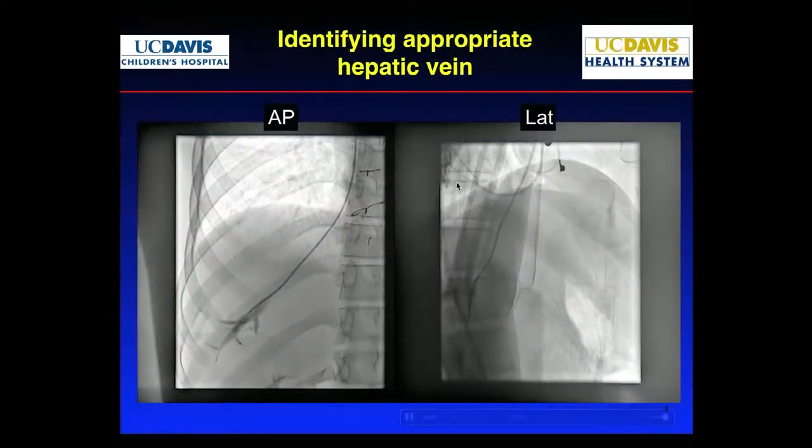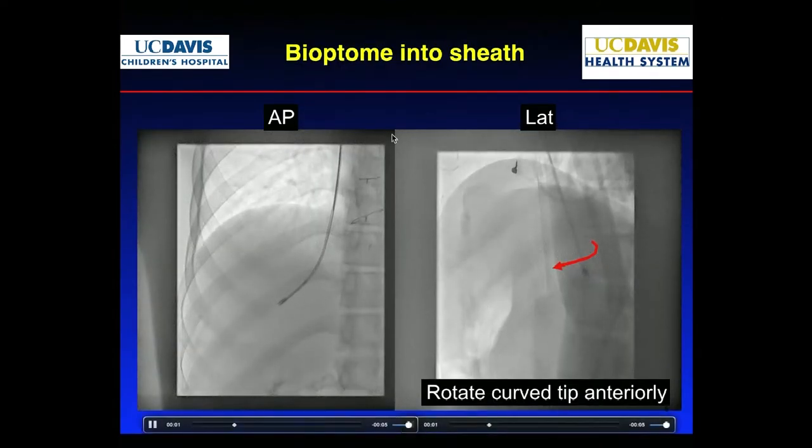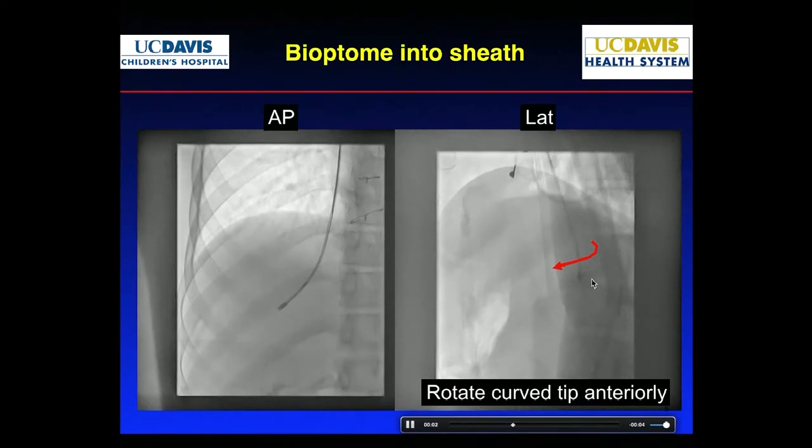So here's an example. There's the catheter. We'll take some pictures, trying to identify the best place to find that lobe area. One of the things that we learned is that when you put your sheath in, it's a very stiff system, so we actually try to rotate anterior. You try to find a posterior segment and then rotate it anterior. That's a really important step, and I'll go over why it's important to rotate anteriorly. You notice that as I'm turning, the red arrow shows that I'm turning this curved system anteriorly towards the front part of the liver.